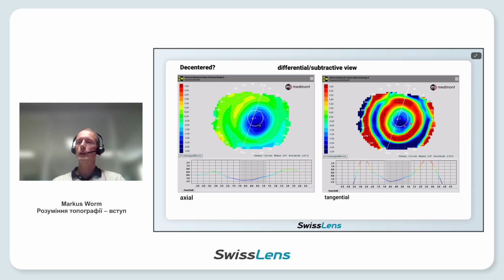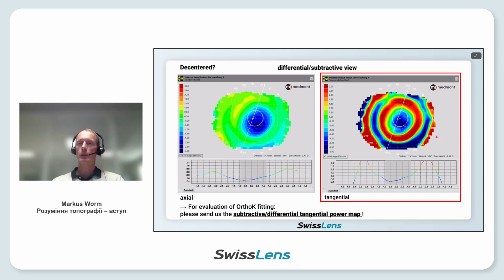Normally, for a modification or an advice, you would always need the first topography and the last one that you have taken. But if you can't send us all topos, all information, the first measurement and the final, please send us this subtractive or differential tangential power map. It will always give us the best information.